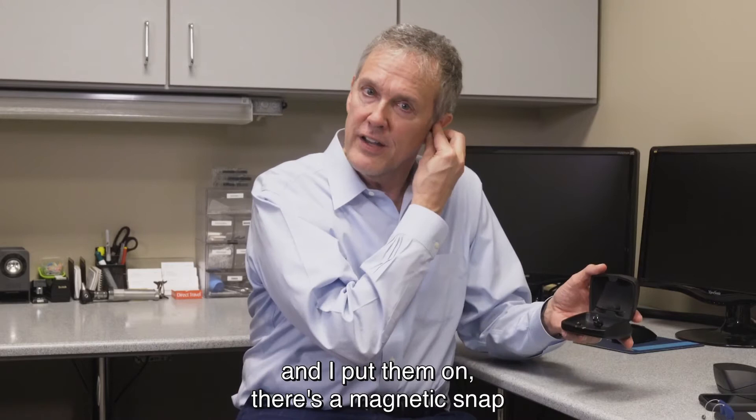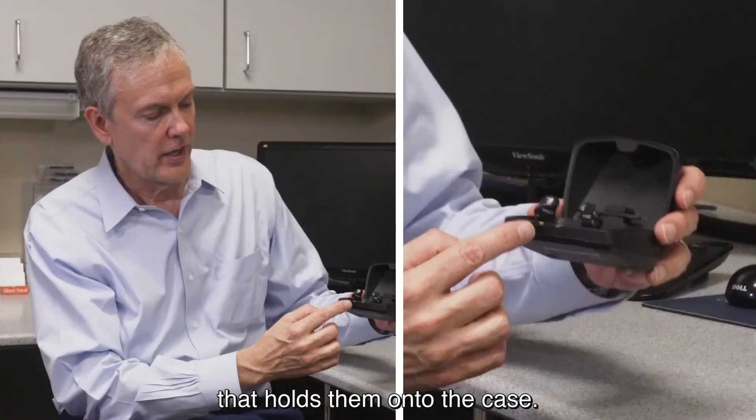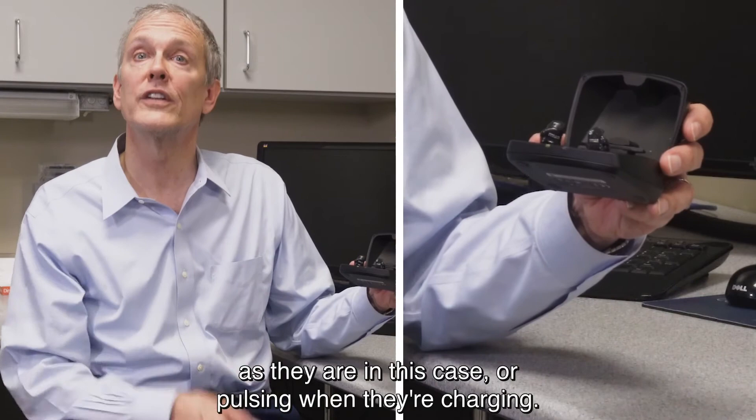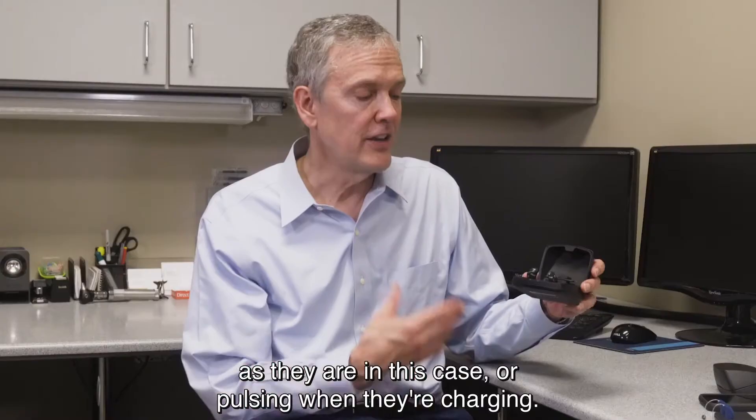First of all, when you remove them from the ears — as I've done with my custom devices in this case — and I put them on, there's a magnetic snap that holds them onto the case. When they're inserted onto the case and securely positioned, you'll see that these lights are solid when they're fully charged, or pulsing when they're charging.